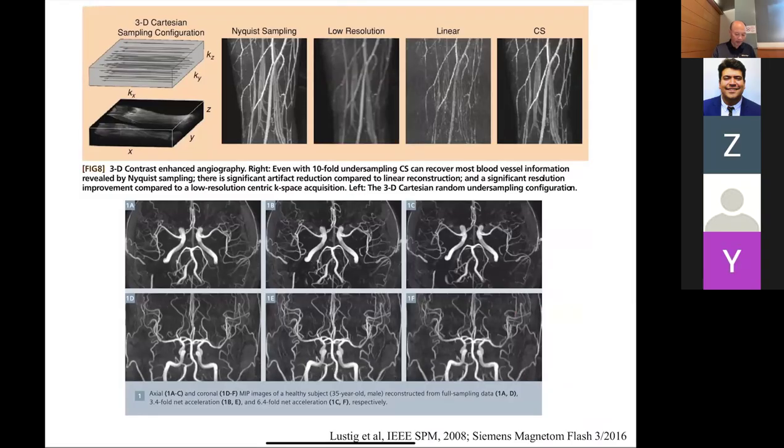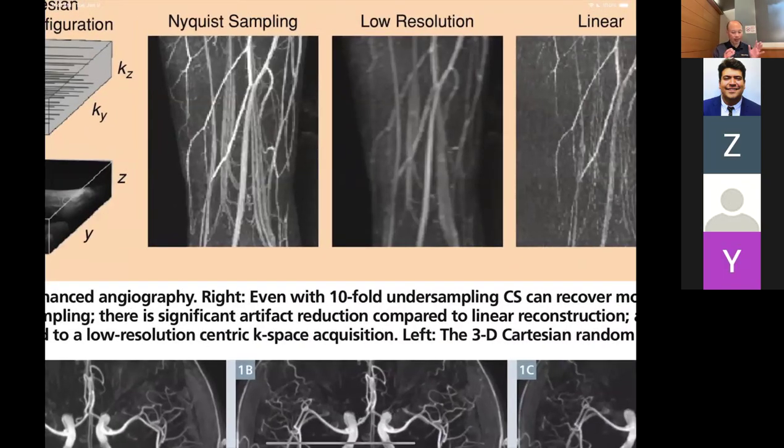So what we're looking at here is an image that is somewhat sparse already, right? If you look at an angiogram, this is an angiogram showing the vessels in someone's leg, then ideally it would just be very sparse. You just have bright stuff where there's vessels and black everywhere else. So there is this idea that even in the image domain, this could be a sparse image, right? So one way to go faster is just to acquire less K-space data, and that's low resolution data. Okay, low resolution. And you can see you're losing some of the details, and some of the vessels are actually disappearing. Like this one here, I don't see it anymore, right?